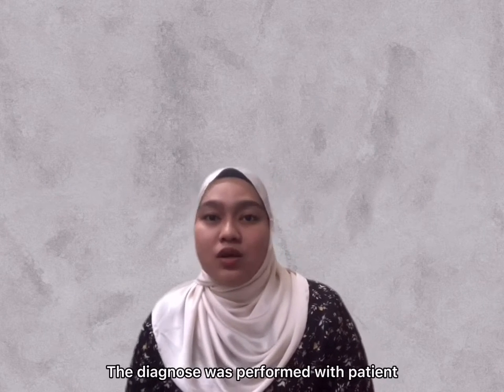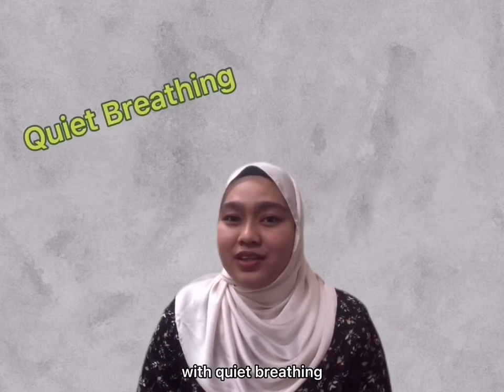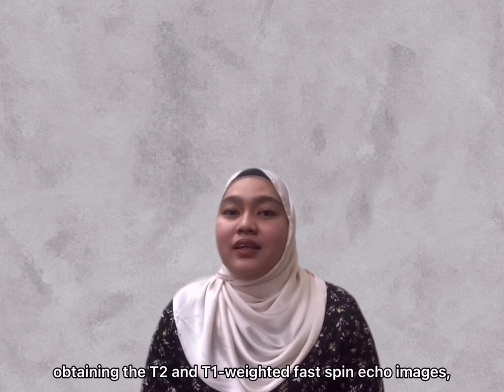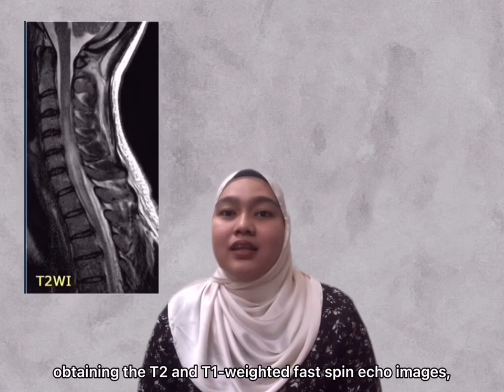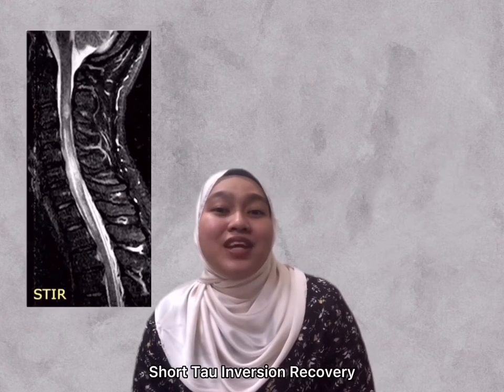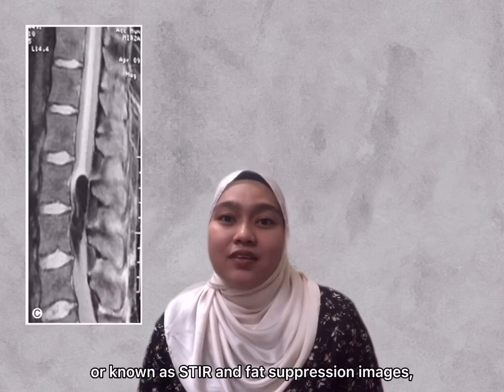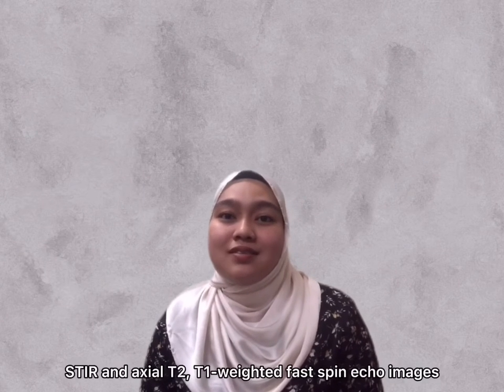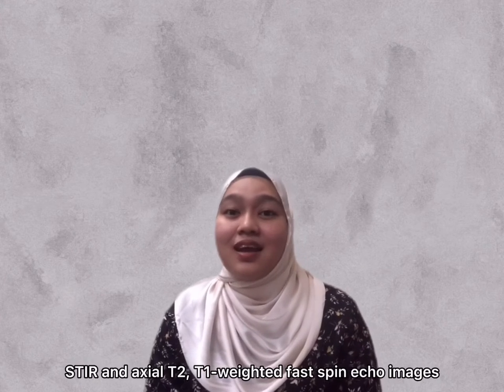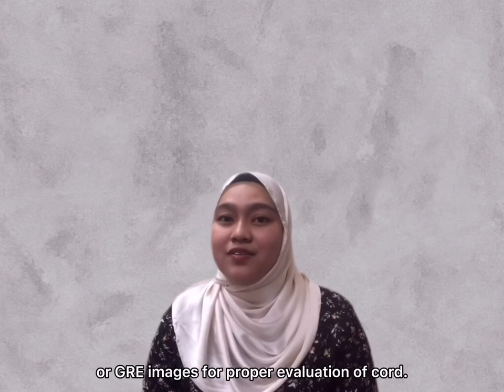The diagnosis is performed with the patient in supine position with quiet breathing and with abdominal band compression, obtaining T2 and T1 weighted fast spin echo images, short tau inversion recovery, also known as STIR, and fat suppression images, coronal STIR and axial T2, T1 weighted fast spin echo images, and gradient recalled echo or GRE images for proper evaluation of the cord.